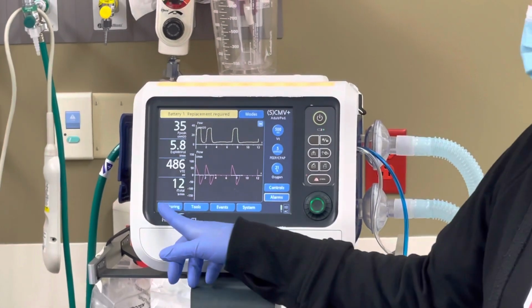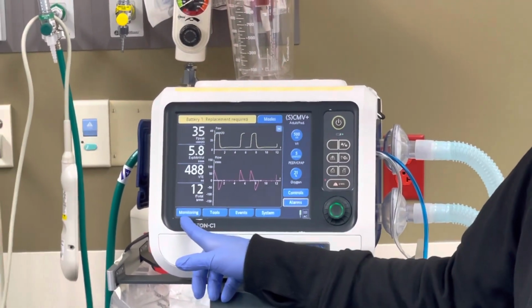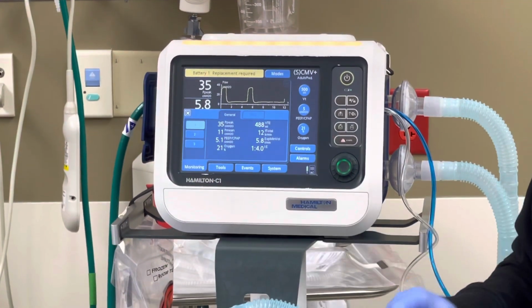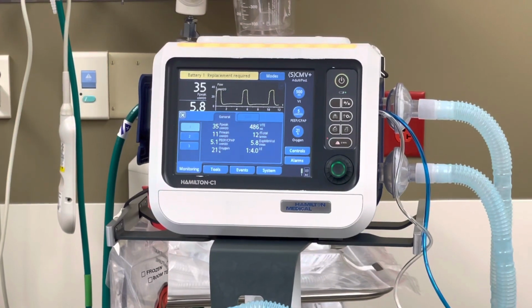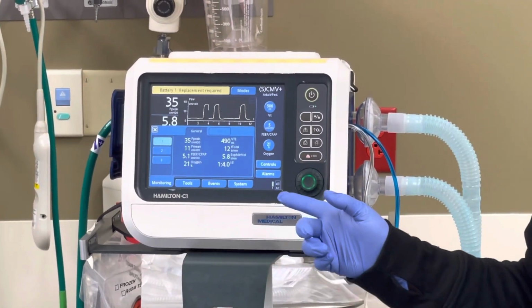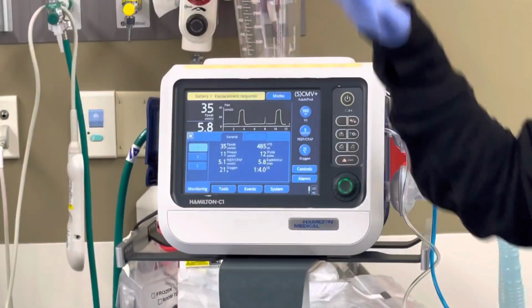When you want to see all of your values of what you're getting from the patient, there's this left tab down here at the bottom called monitoring. You're going to click that monitoring tab. This is going to bring up everything: your peak pressures, your mean, your PEEP, your FiO2, your exhale tidal volume, your respiratory rate, and your minute ventilation. So everything's going to be here.